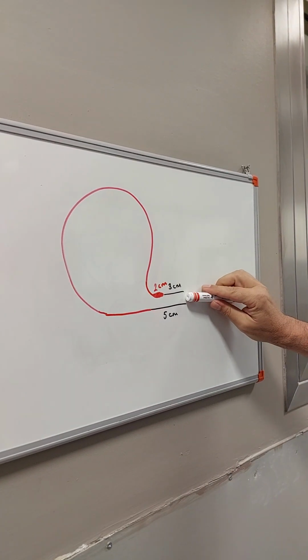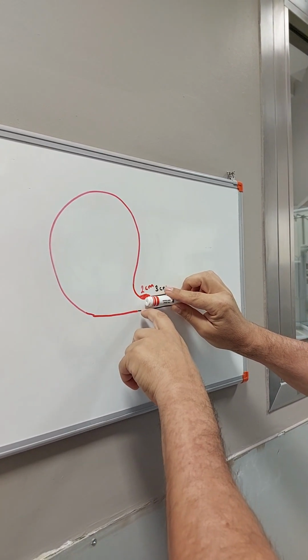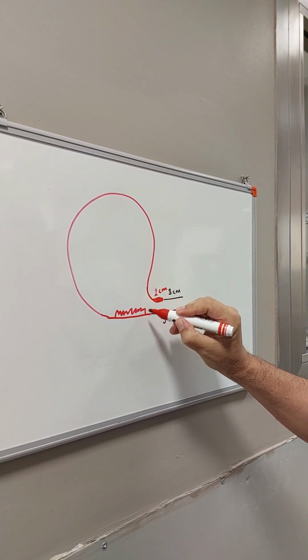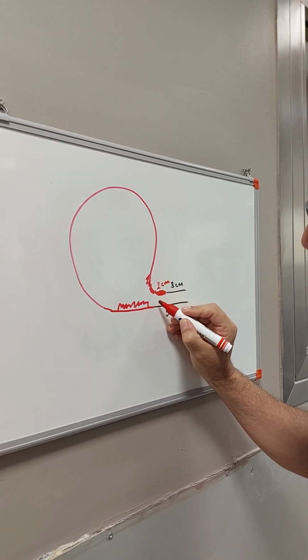And when we look with the camera, we think that this is urethra and we don't touch this part. So we move inside and fulgurate the tissues here, the leukoplakias here, and in the bladder neck. We do all of this part, but we are always missing some part.